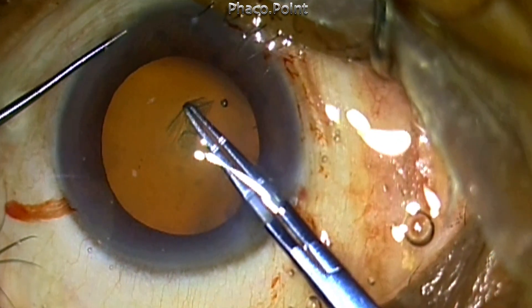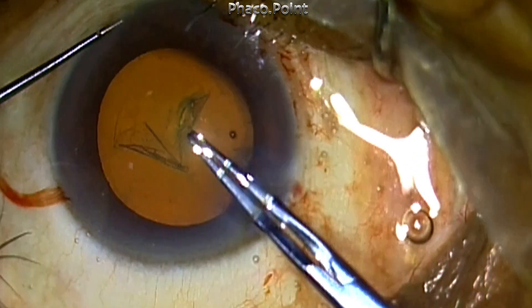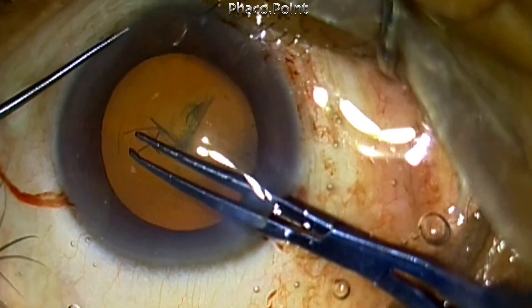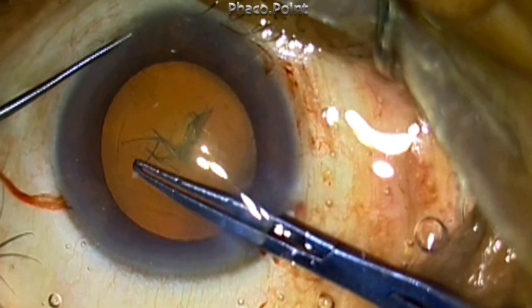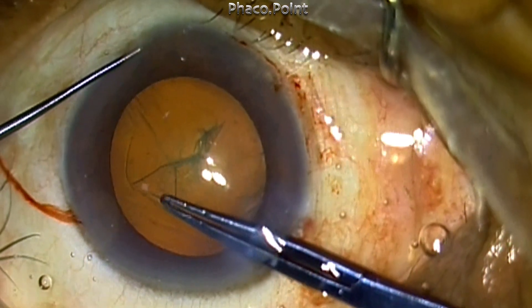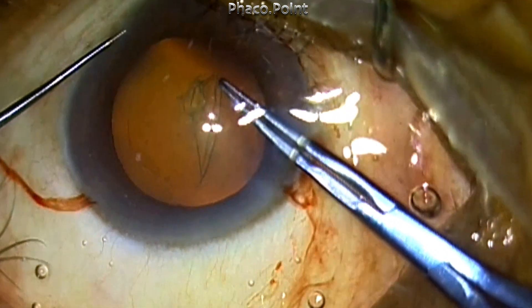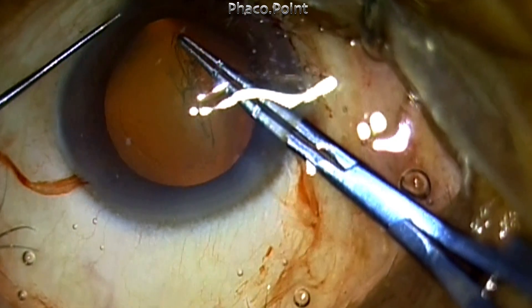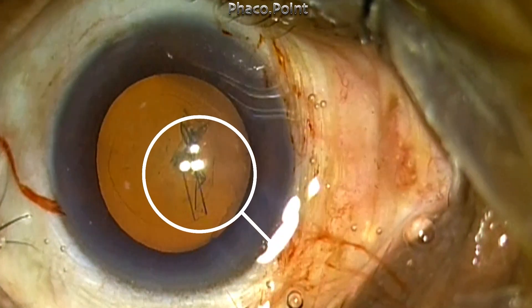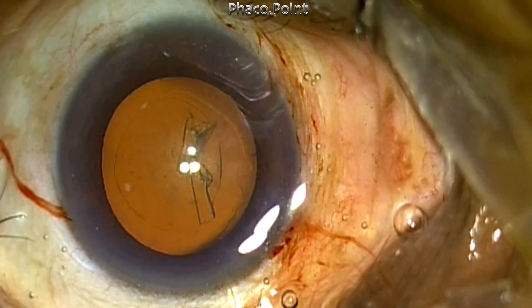The flap is torn in an anti-clockwise fashion starting from the right at the point of entry. Now when this is done, as the tear progresses and you reach the sub-incisional area, a considerable amount of folds of the capsule are left behind, which has a tendency to slip out of the main incision and create problems.